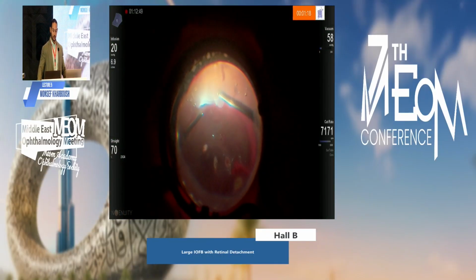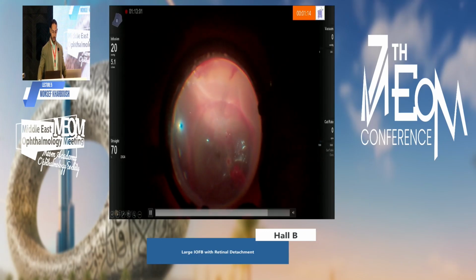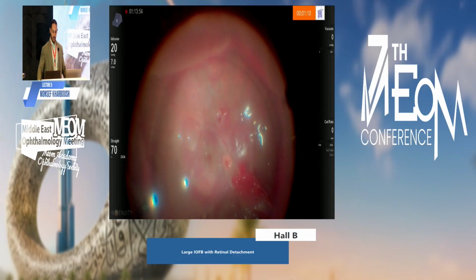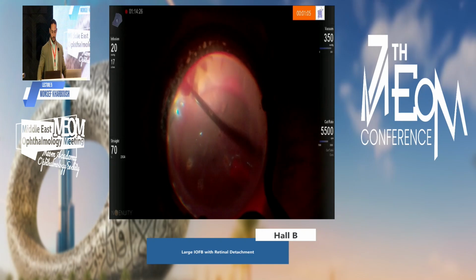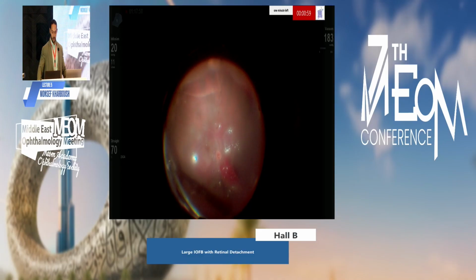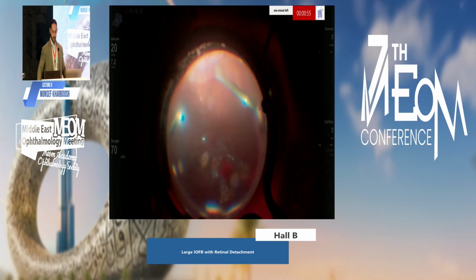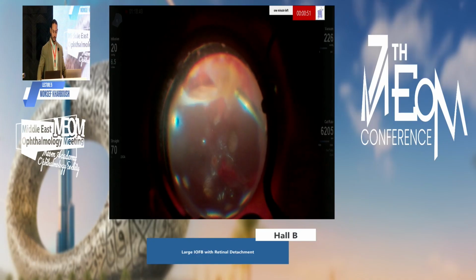to complete our vitrectomy, doing the vitreous shaving. Of course, we have a very large break inferiorly that will be visible in a moment, increasing the PFC bubble to the edge of the breaks. You can see here. Trimming again the vitreous base. We have a small break here, and the large one will be visible in a short moment. It's already there under this organized hemorrhage.